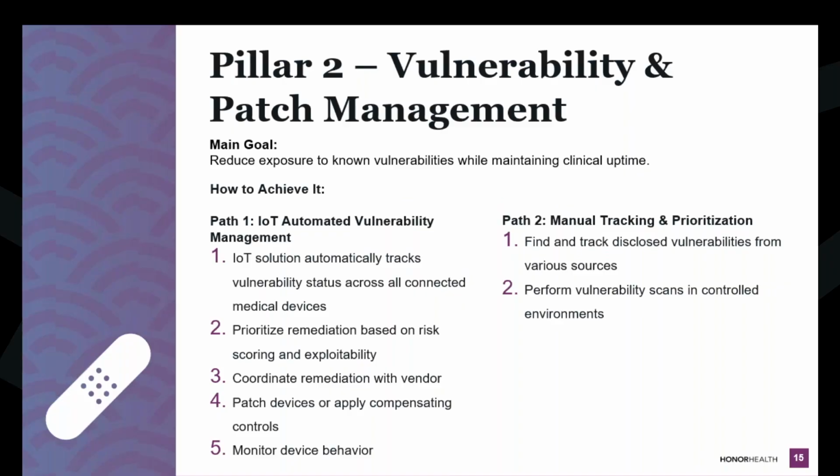Then you can also perform vulnerability scans. I touched on those a little bit earlier. Vulnerability scans, something to keep in mind with medical devices. They're great. I'm a big fan of them. However, you need to make sure that it is in a highly controlled environment, meaning your piece of equipment is either in the incoming inspection phase or it is out for PM or CM. So no patient is using this piece of equipment, and there's a technician right there. That's how my team is handling all these vulnerability scans. We make sure that someone is physically in front of the device to make sure it's not in clinical use.